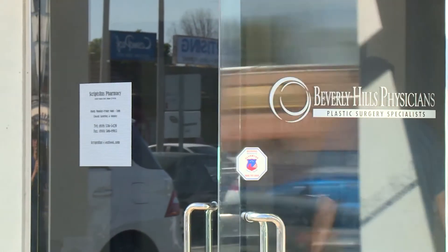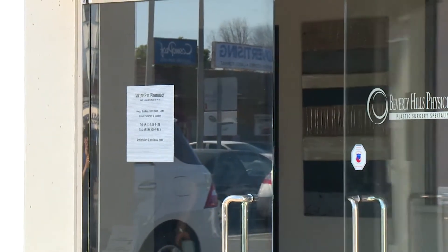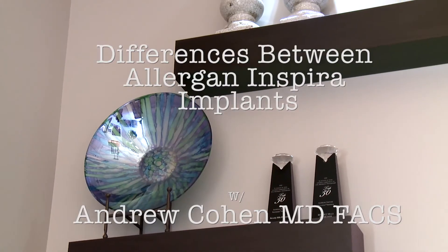Hi, I'm Andrew Cohen, board-certified plastic surgeon. I wanted to show you today the differences of the Allergan Inspira silicone gel implant.